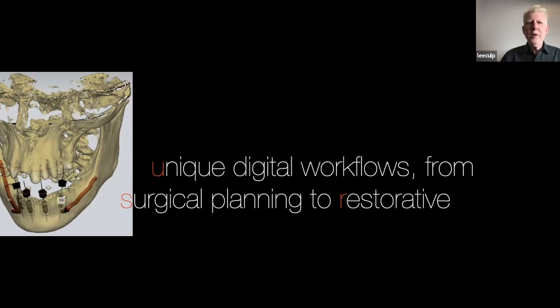So for intraoral scanning of dentures, it is absolutely not predictable. So you really have to look at those scans, and it has to be complete. So if you're doing a mandible and you're looking at your final scans, because I cannot make up data. And let's say you're on the lower right of the mandible and you're scanning, everything's really good. But when you go check it, you're missing a little piece that kind of goes from the vestibule up to the top of the ridge. I can't make a denture. I can't fill that in. So if you can get a beautiful scan, which we've done, but it's just difficult to do.